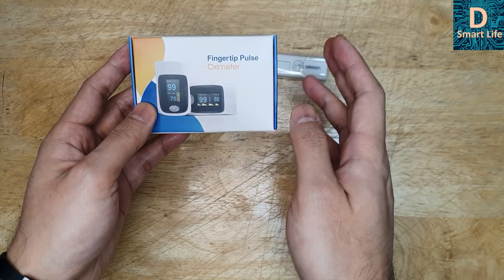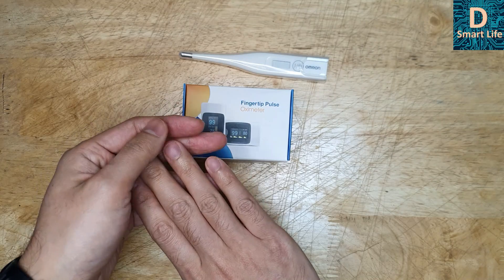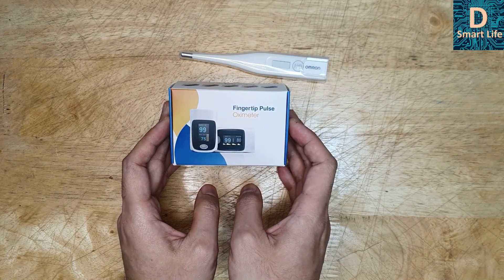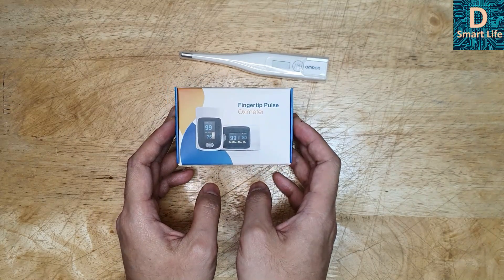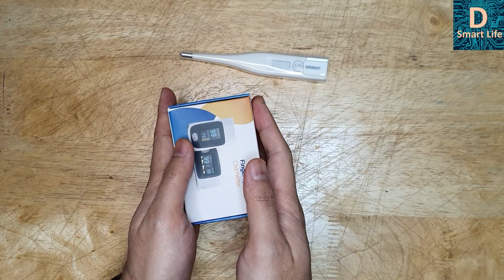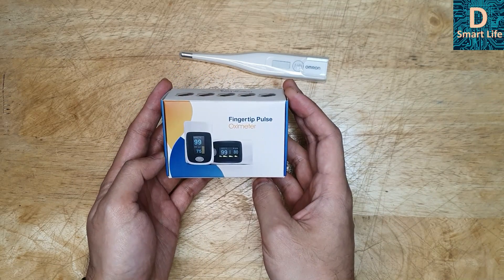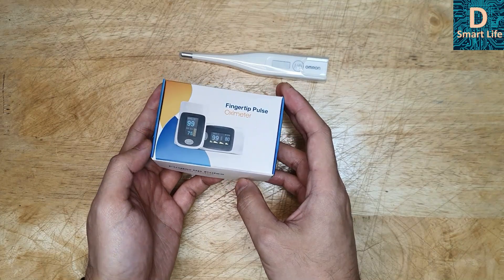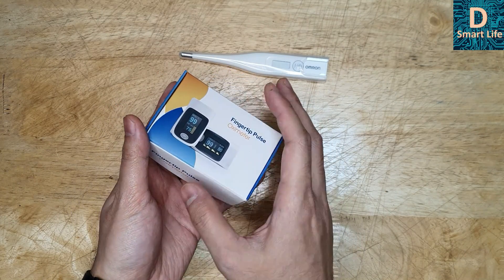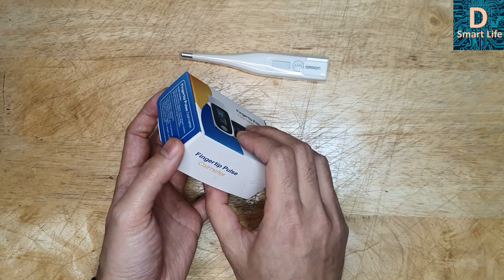The next thing is the oximeter — a pulse oximeter. It can measure the oxygen level in your blood. It's not a very expensive device; you can get it online for around $15. It is very small, easy to use, and user-friendly. Let's unbox this and I'll show you how to use it, what its functions are, and how it detects blood oxygen levels.